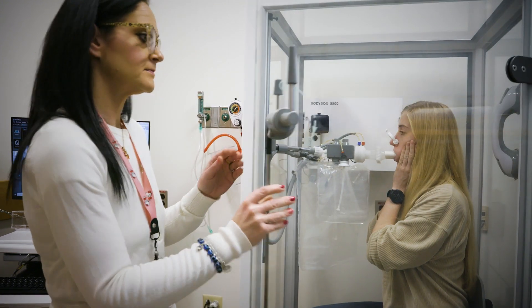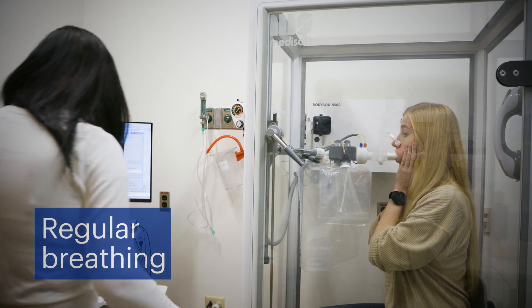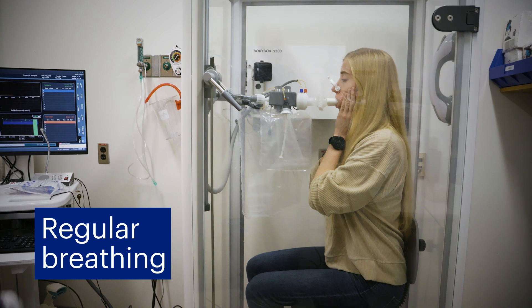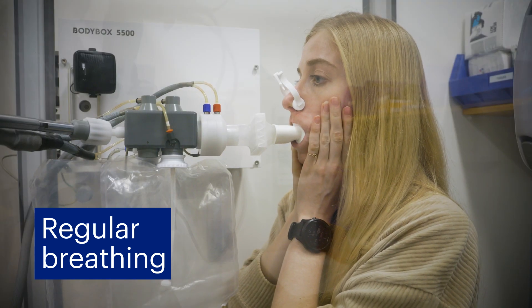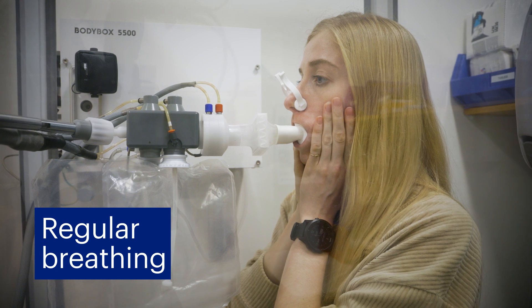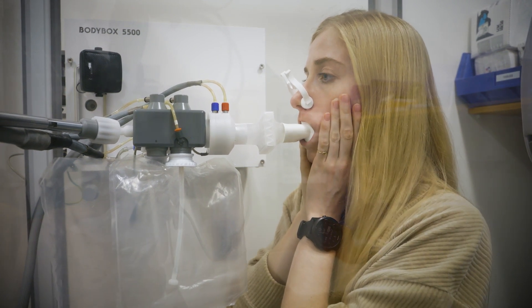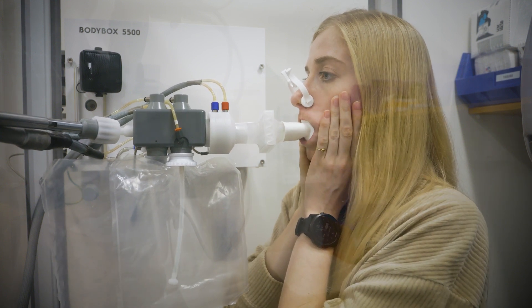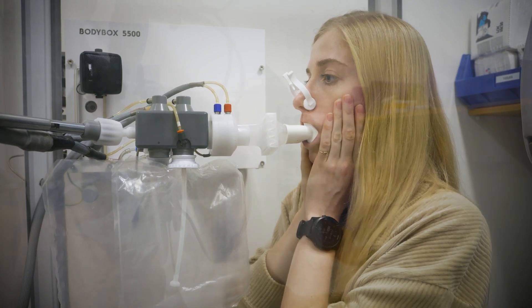If you get anxious in closed spaces, please let the technician know. You will start by breathing normally with your hands on your cheeks. After a few breaths, you'll be asked to take short, quick, and shallow breaths at a breathing rate of around one breath per second. At one point, the tube will be blocked for only a few seconds. It will become hard to breathe, and that may feel slightly uncomfortable, but keep going until you're told to stop.